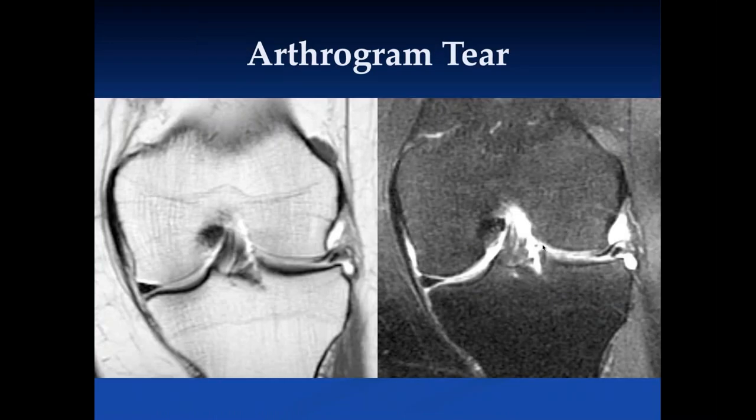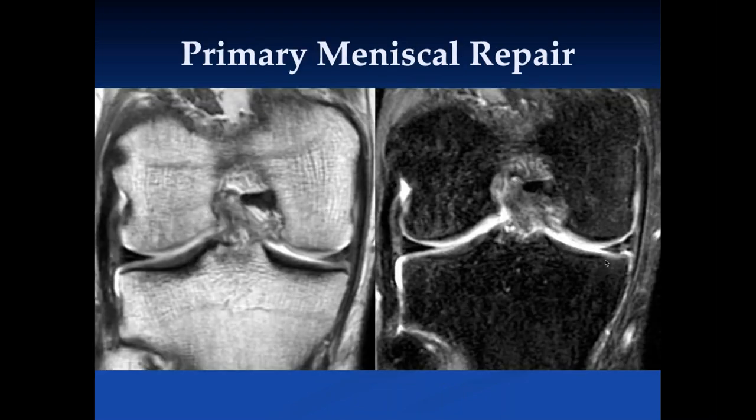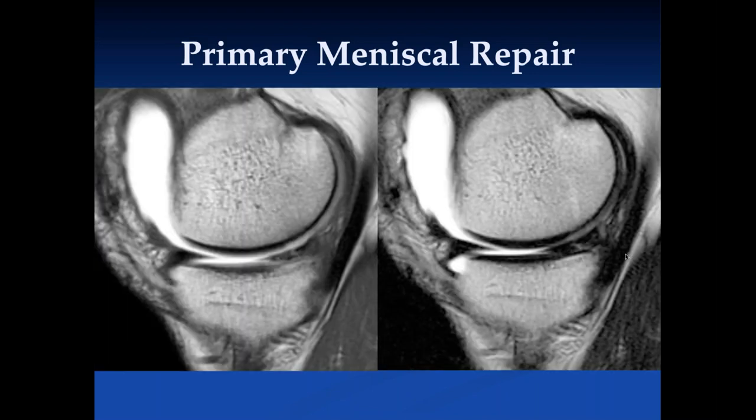Here we can see a tear in an arthrogram patient where a little contrast extends into the defect. Here's a patient who had primary meniscal repair — people like to give contrast to see whether it extends into the area of the repair to assess mechanical integrity. In this case, contrast does not go into the area of increased signal intensity within the meniscus, presumably meaning that this meniscus is stable and should not be re-operated on.